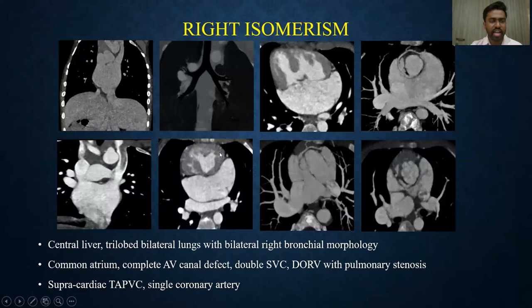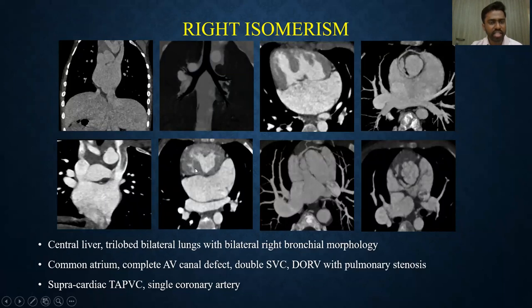Coming to the right isomerism case: the liver was centrally located and the bilateral bronchi showed right-sided morphology with trilobed lungs, a common atrium with complete AV canal defect, persistent left superior vena cava, double outlet right ventricle with pulmonary stenosis having bilateral subarterial conus, and a single coronary artery arising from the posterior facing sinus. This patient had a supracardiac TAPVC, with the common chamber ascending and draining into the superior vena cava.